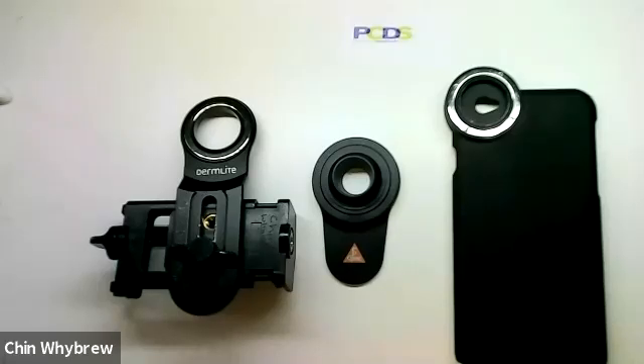Hello everybody. These are some of the standard phone adapters that you can get to attach your dermatoscope to your mobile phone. Today I'm just going to be showing you the equipment. To learn in more detail about how to use it and how to interpret what you're looking at, please do come along to one of our Dermoscopy for Absolute Beginners courses.